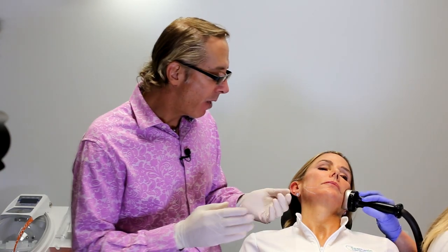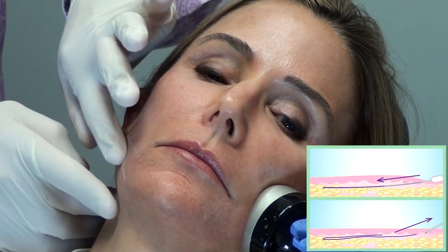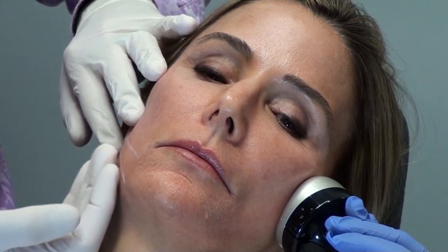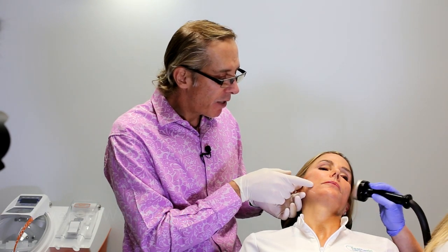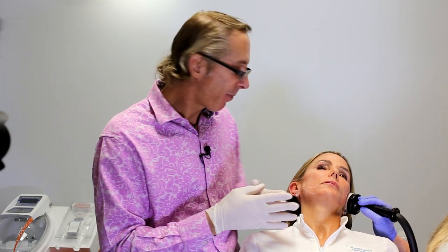So what you do is, for the barbed threads, you numb the skin a little bit, and I'll show you how to do this, and then you insert it, and then you gently retract on the skin, and that causes the barbs to be engaged. In this area, the smooth threads, you just insert like in a crisscross fashion or hashtag fashion, and over time, the body reacts to these sutures by creating collagen. So you can almost imagine that this creates almost like a tendon of collagen that lifts this corner of the mouth and marionette area. The results last for 12 to 18 months, and then they need to be redone.